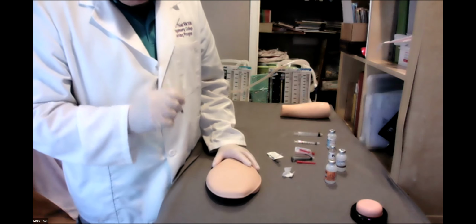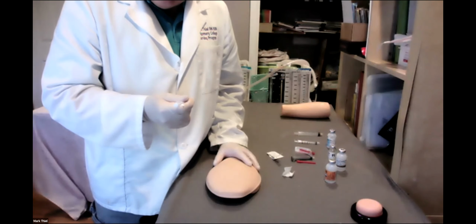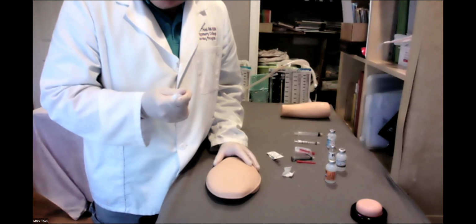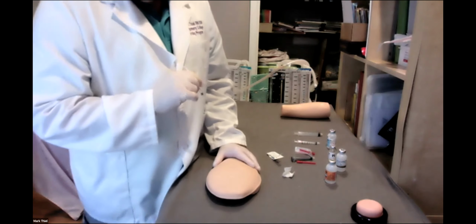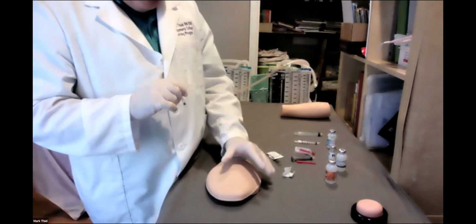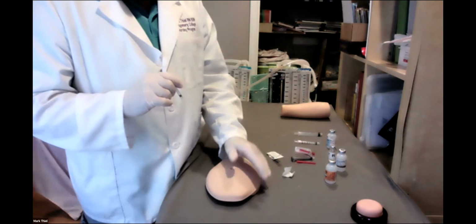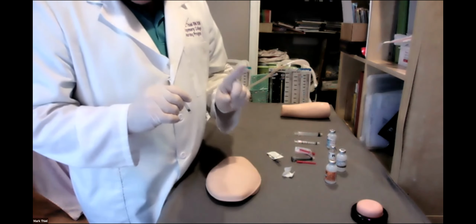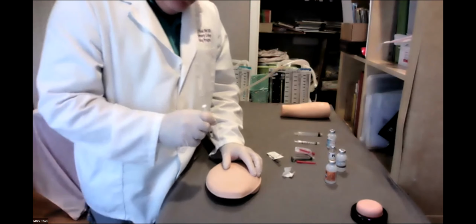In somebody who is very thin, a child, and or a child that does not have a lot of subcutaneous tissue, we go in at a 45-degree angle. With adequate subcutaneous tissue, we do not have to do what you may have heard is the pinch. Now, proper evidence based is that you don't need to do the pinch with adequate sub-Q. Right?